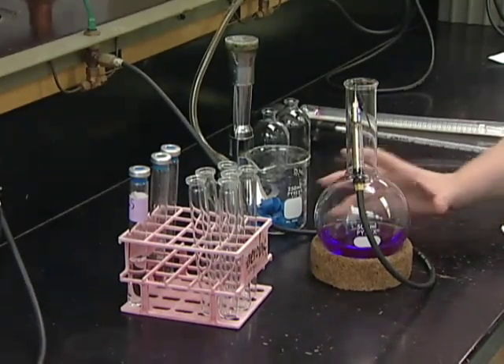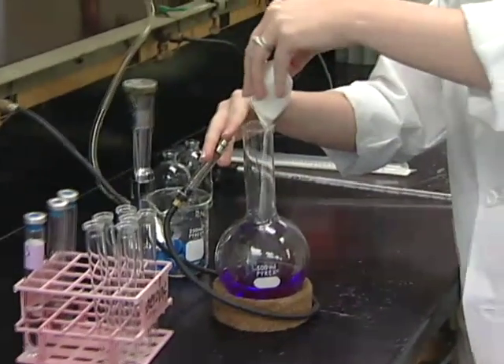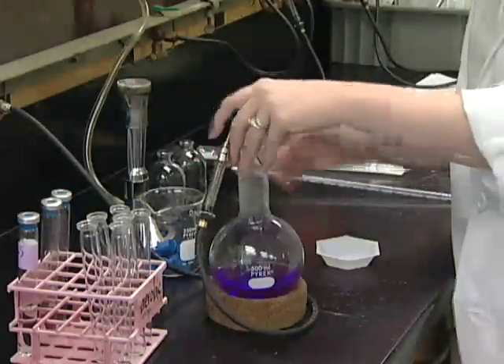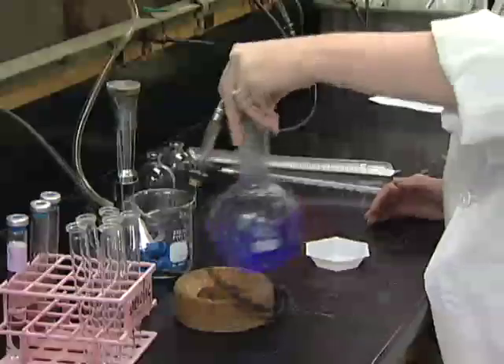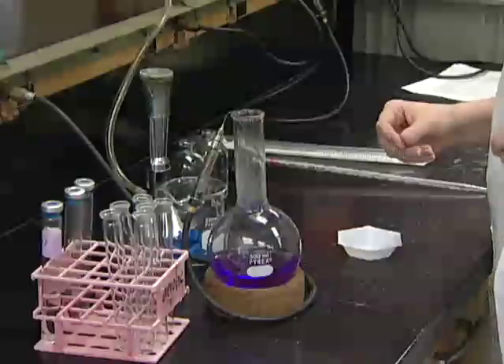Now that your media is cooled back to room temp, we'll add our sodium bicarbonate. This is the buffer that we use in this particular media. You'll get it to dissolve by swirling it around, and if there's any stuck to the sides, we'll remove that right before we dispense our media.